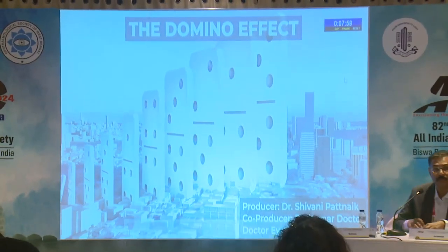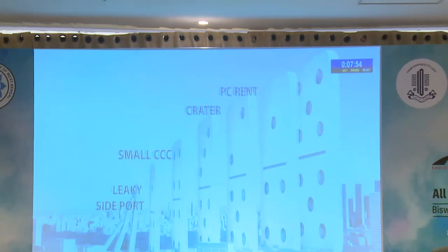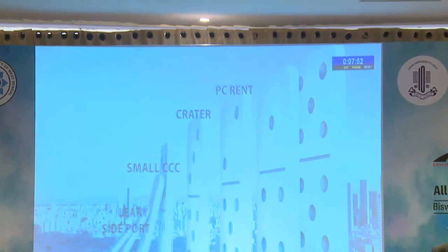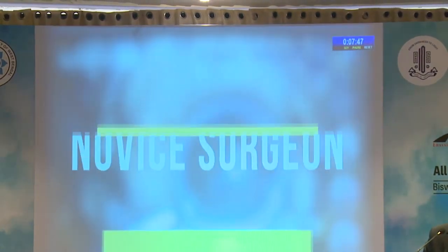So my presentation is the domino effect. This is a series of cases in which one step has led to the other, and then finally has led to a PC rent. Let us see what we've learned from these cases.